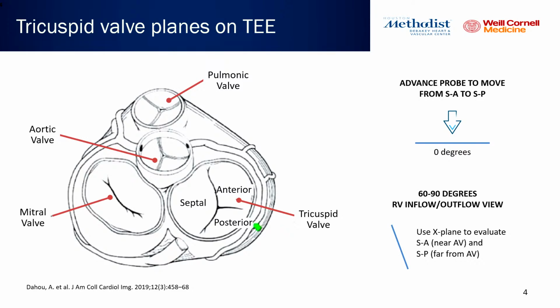A little bit of echo focus anatomy. I know we don't have any echo pictures here, but this is our quote unquote surgeon's view of the tricuspid valve and mitral valve, and you see the aortic valve in the middle in short axis, which is a view we usually obtain as our inflow-outflow, both on TTE and on TEE.